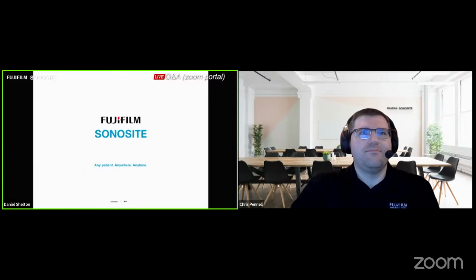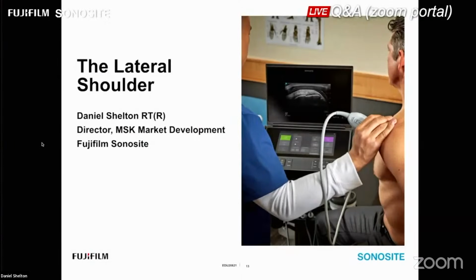All right, thank you, Chris, for that introduction. I want to welcome everybody again. This is the lateral shoulder, part 2 of our four-part series. If you did not catch the anterior shoulder, I encourage you to go back through our webinar library and get caught up on the anterior shoulder and the associated artifacts with musculoskeletal ultrasound, such as anisotropic artifact or angle artifact. We'll discuss a little bit of that here, but it was more in depth in the first of the four-part series.